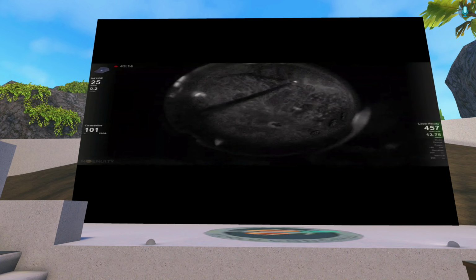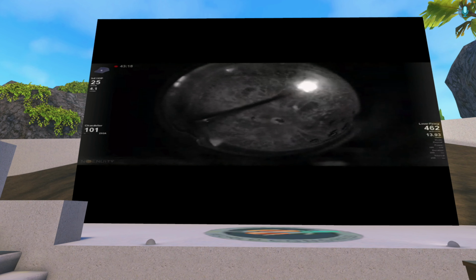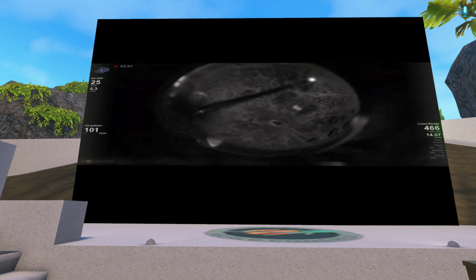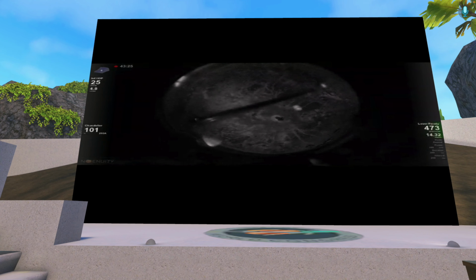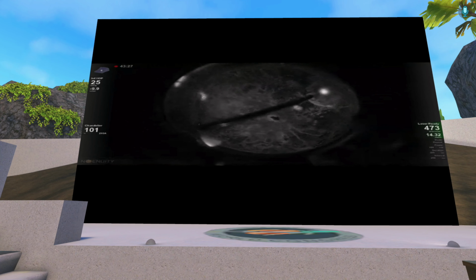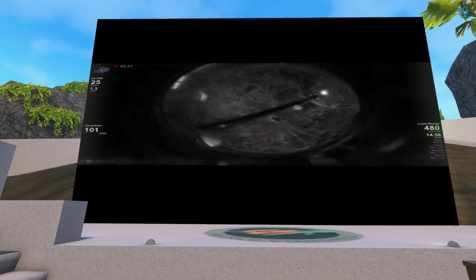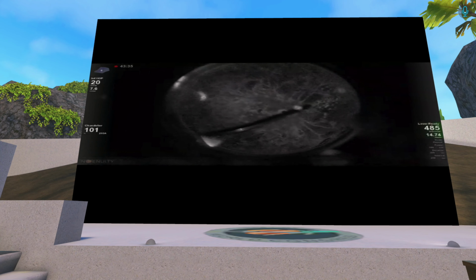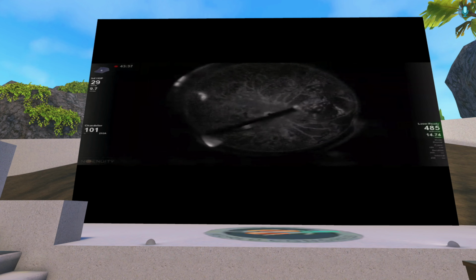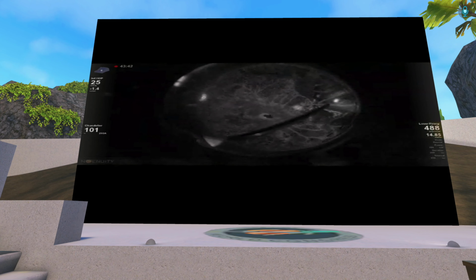So if we have a good setup of image excitation and digital filter to capture the fluorescence, actually we might see pretty well the areas of non-perfusion and the areas that we need to laser. Also, what I would advise is during this laser to lower the power of the aiming beam, just to not interfere to the rest of the image.